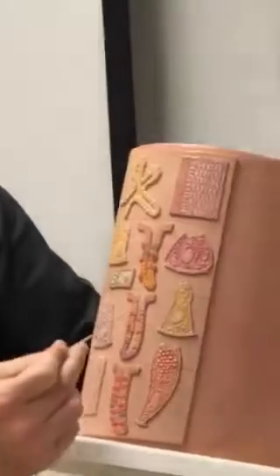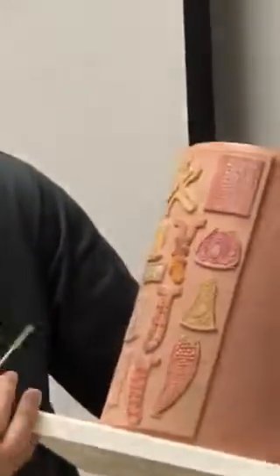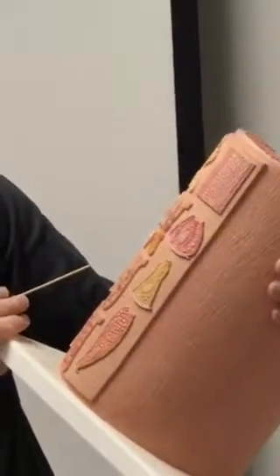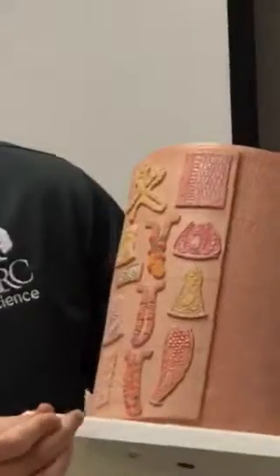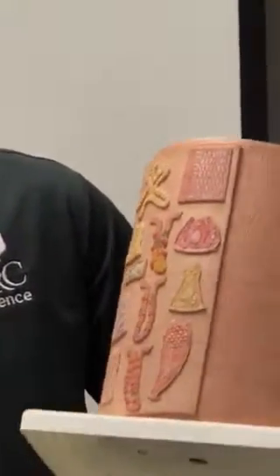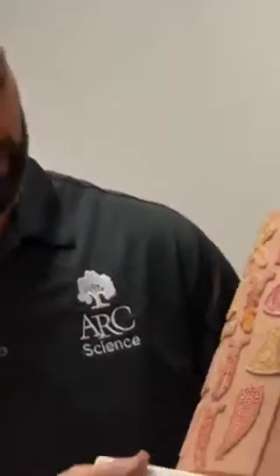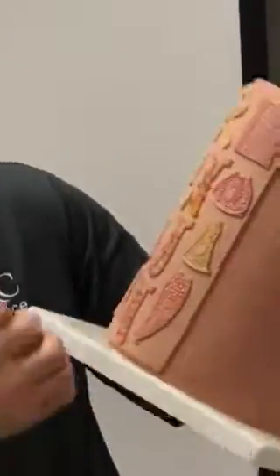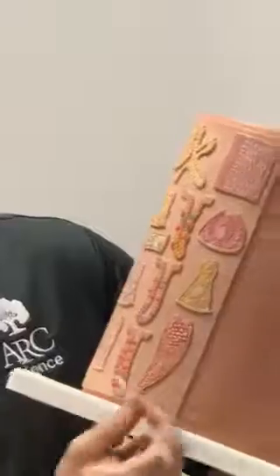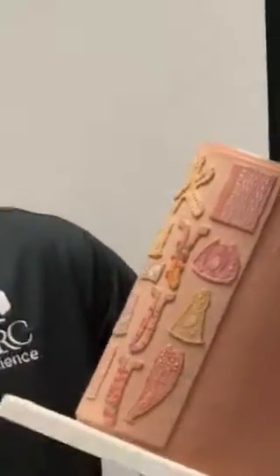And this gland here, intestinal gland or intestinal crypt. I wonder if this is a Paneth cell. Not really sure. And then same thing down here. Intestinal gland, mucosal glands, intestinal crypts. But since this is large intestine, more goblet cells. Oh, that's what these red ones are. So up here it's parietal, but these ones down here, these are goblet, and they did put more in the large intestine, so that's good. That's definitely the case.